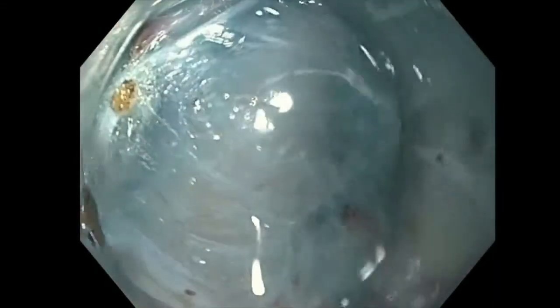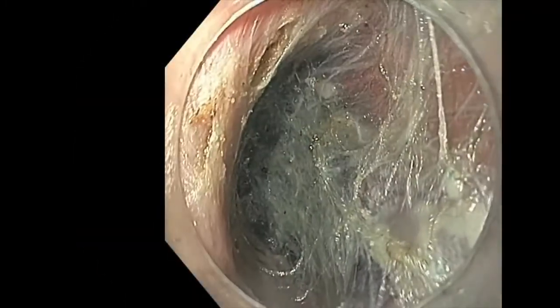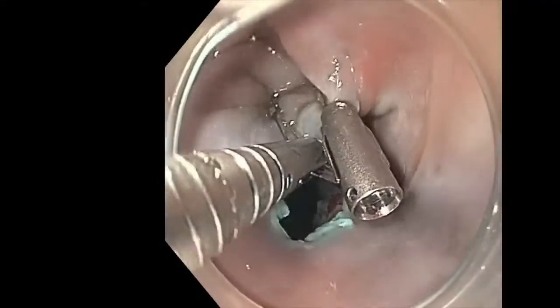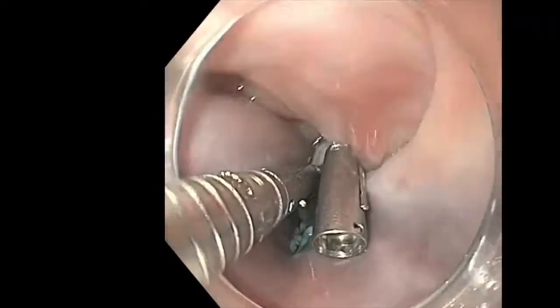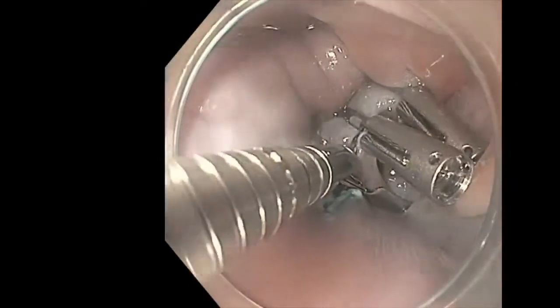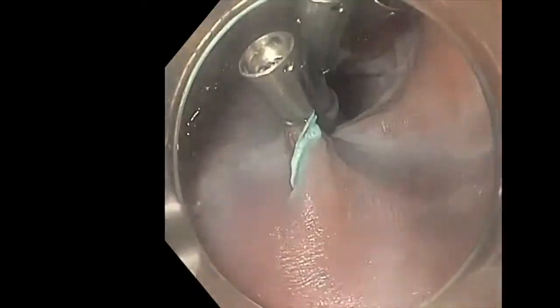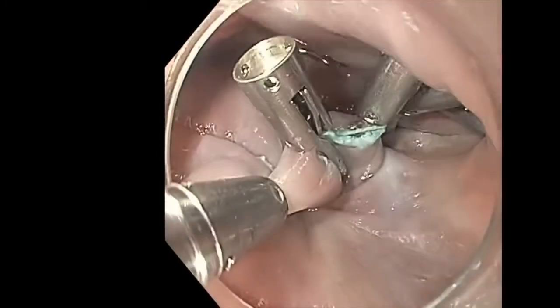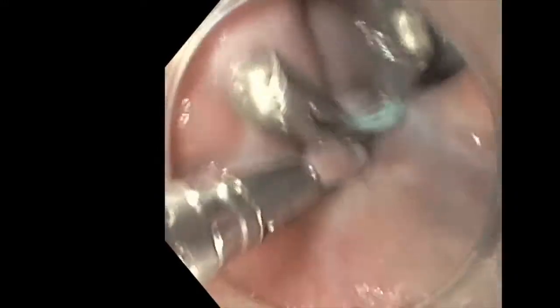Once the submucosal space is entered, the septum is visualized, and dissection is performed on either side, followed by full-thickness myotomy through the cricopharyngeus and into esophageal muscle. Notably, working space during mucosal closure is larger, reducing technical difficulty and improving visualization of closure adequacy. This theoretically reduces the risk of leak and is now the preferred technique at our institution. We prefer short stem clips due to the proximal location, as this decreases the foreign body sensation for patients.